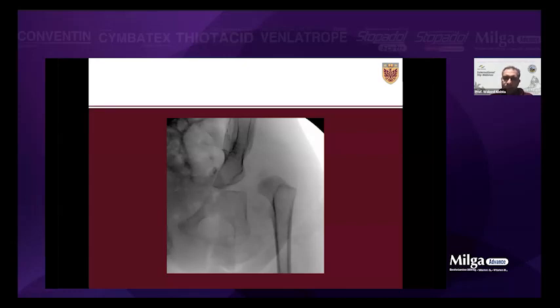Then you look at the lateral cutaneous nerve of the thigh. If you don't see it, if you don't find it, don't waste your time looking for it. Just start a little bit lateral. So what will be the interval you're looking for at this stage? I've seen Dr. Noor mention looking at the fascia. That's a good point. But what will be the interval at this stage distal to the ASIS?